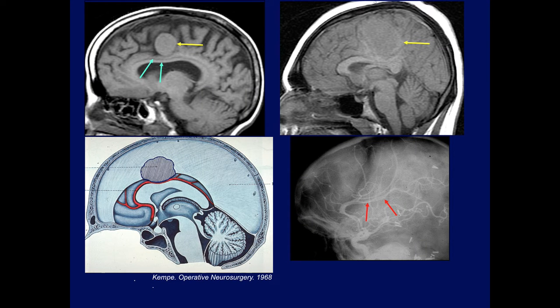I'll be continuing today with my talk about meningiomas. There are several images that I did not use in my prior talks because I did not have the reference for the beautiful pictures, but I finally found the reference, so I'm adding these few slides.